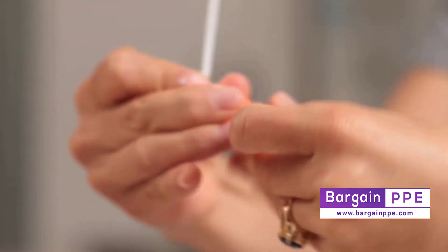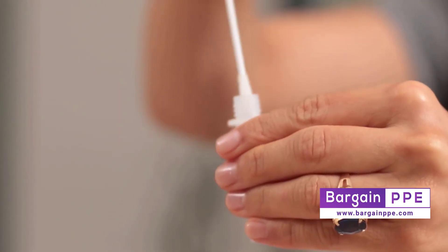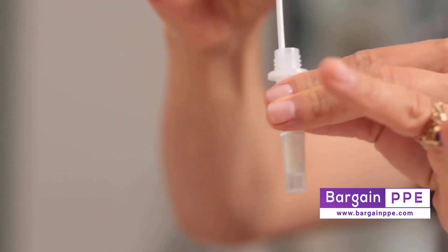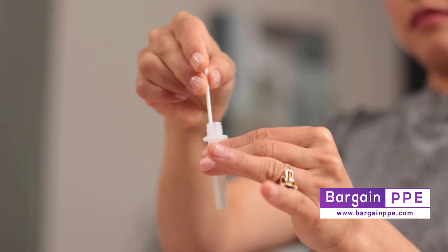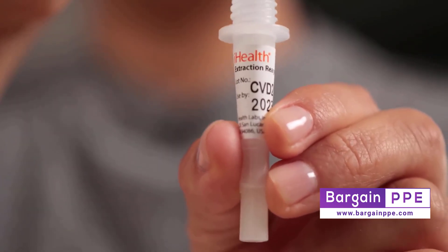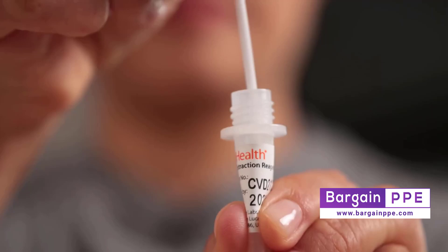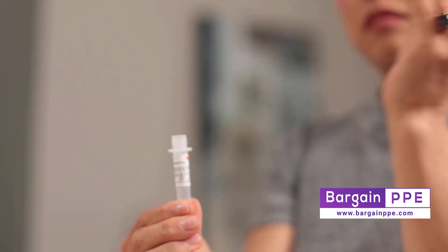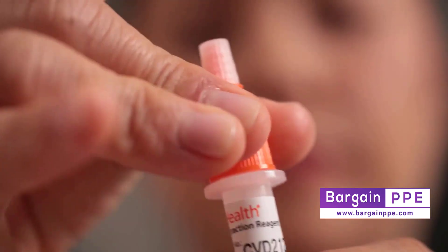After swabbing both nostrils and without letting the swab touch anything else, remove the large lid from your test tube and insert the swab all the way into the solution. Twist it back and forth in the solution at least 15 times. As you're removing the swab from the tube, squeeze the sides of the tube to wring every last drop of solution and sample out of that swab. Then replace the large lid back onto the tube.